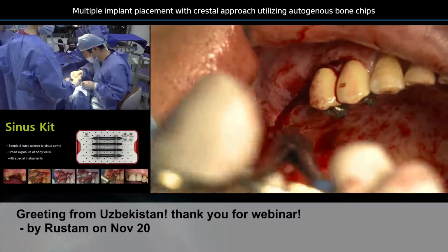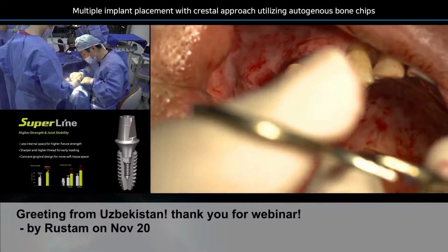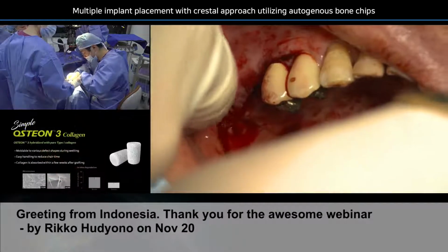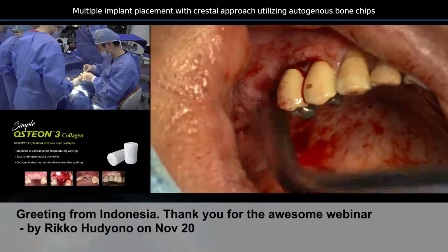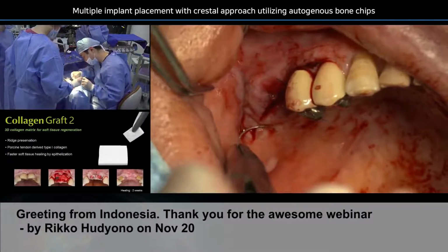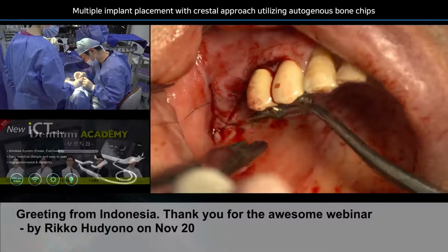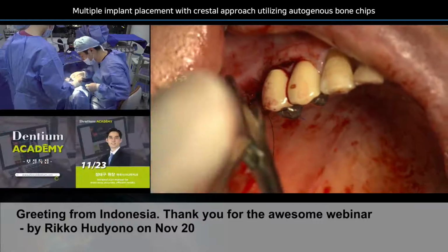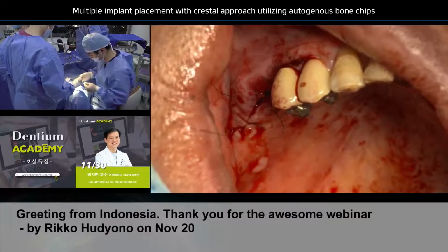So this 6-0 suture, if you had no chance to use it, today I recommend you, someday you have to use this 6-0. Otherwise, you will not see the beautiful healing results. But if you just change the suture material to 6-0, your surgery healing and the results will be completely different from the previous surgeries. So whenever you have a chance, use these 6-0 sutures, starting from maybe Monday next week. If you only change the suture, it will give you a whole new world for the operation.